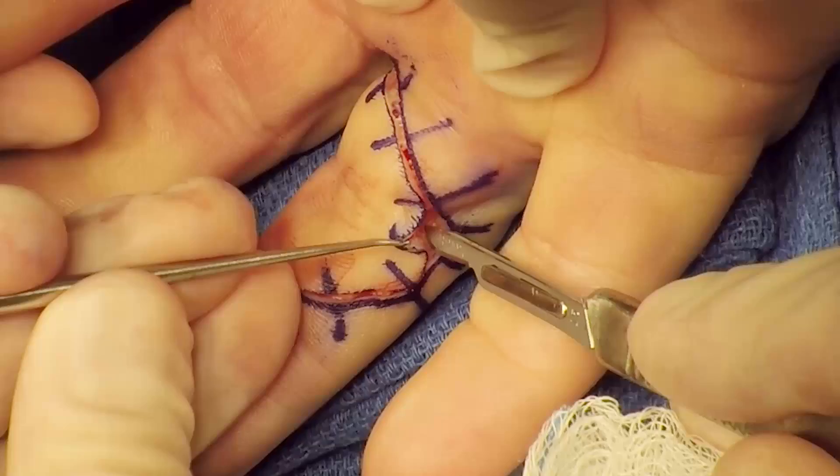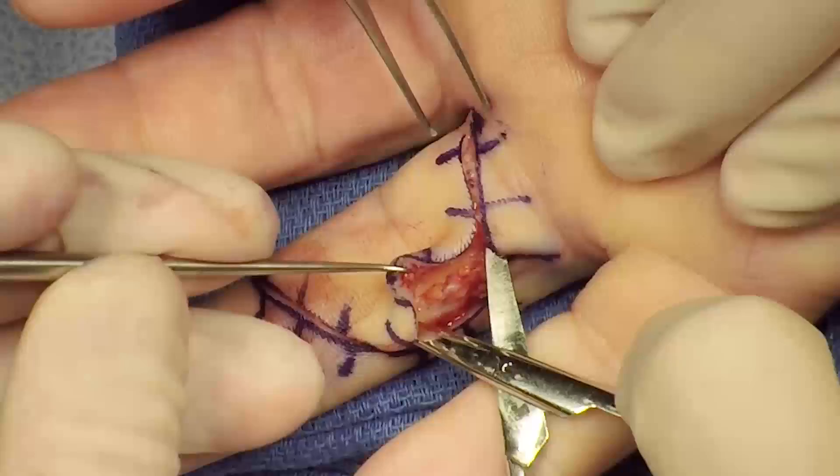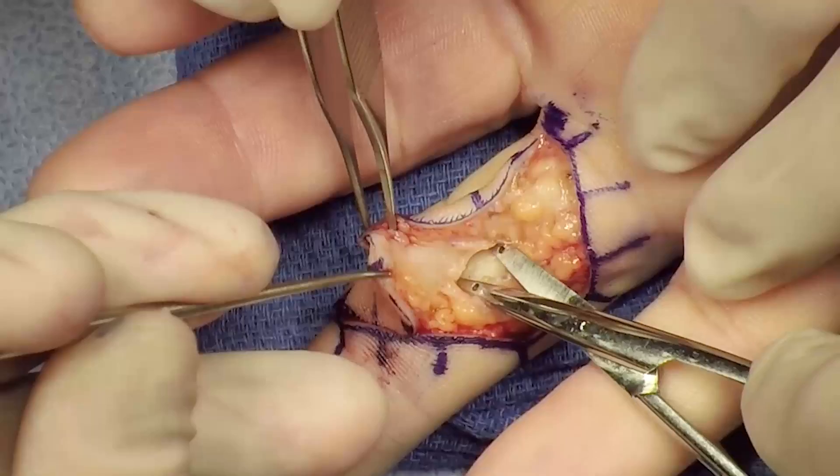Using sharp dissection, the flap is elevated superficial to the neurovascular bundle. The neurovascular bundle is identified and the dissection is taken down to the flexor sheath.